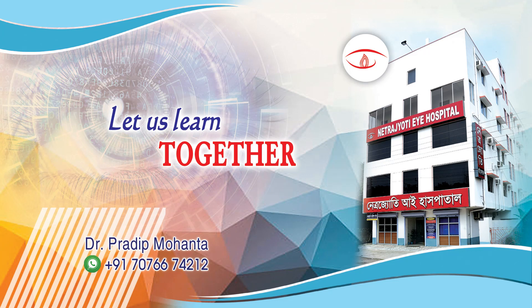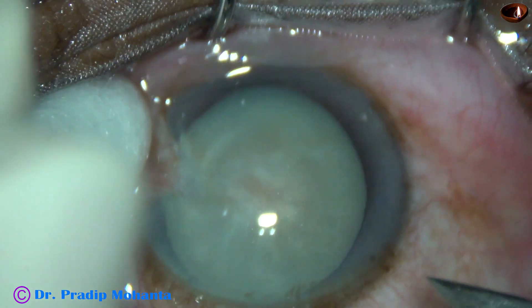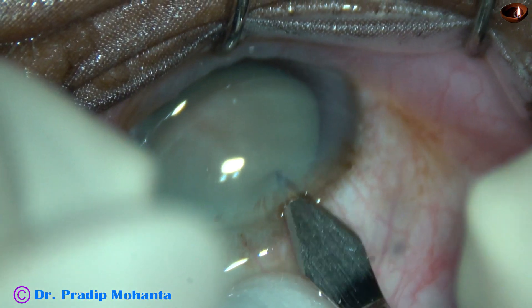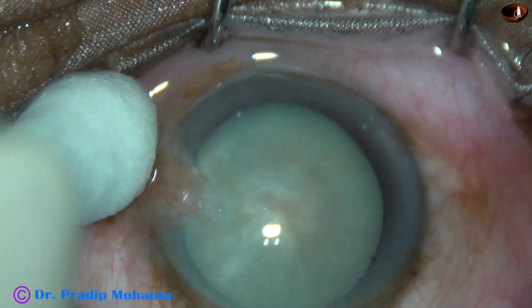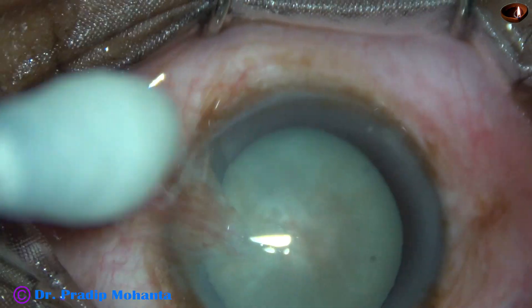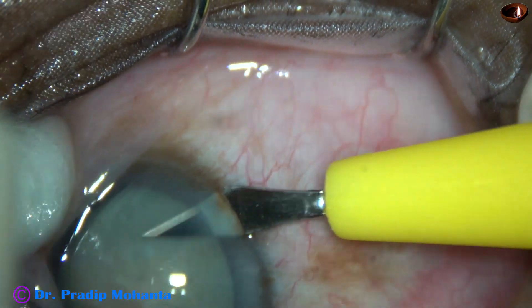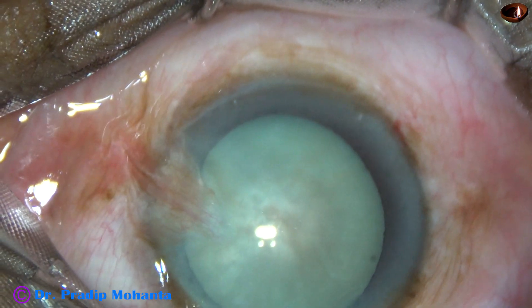Friends, welcome to my workplace at Ranaghat, West Bengal, India. This is a mature white non-intumescent cataract. In this case, I tried bevel-down chop, bevel-down direct chop, and I became successful.